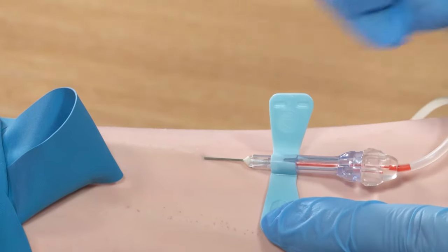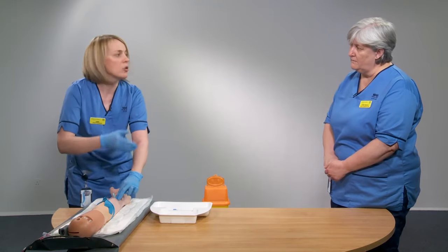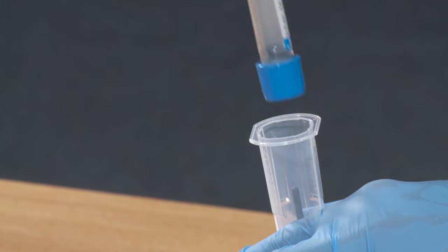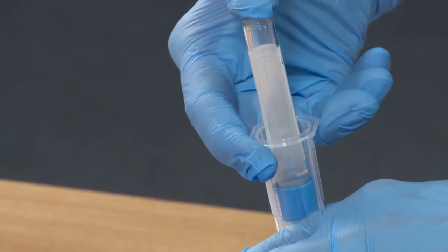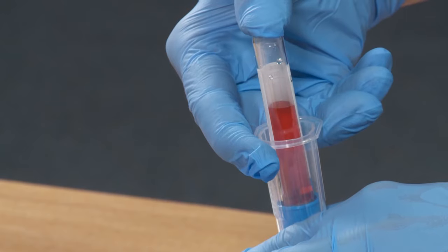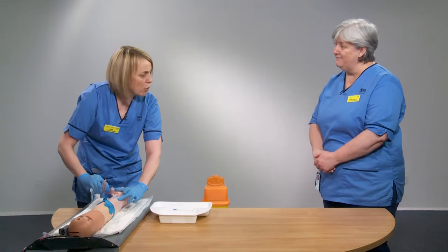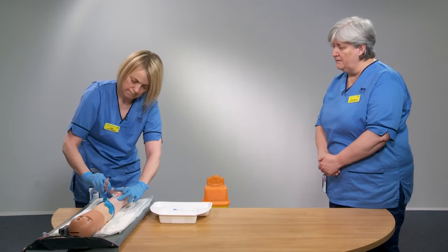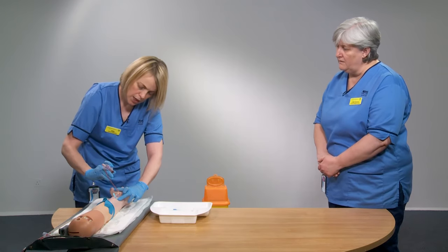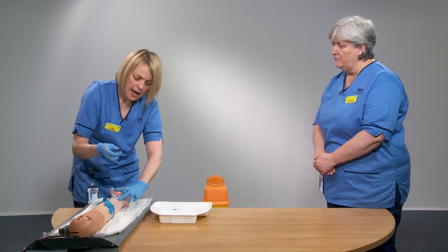To collect the blood, flatten one wing with one hand to stabilise the needle and prevent it dislodging, then use the other hand to attach the blood bottles into the vacuette. You will see blood travelling down the chamber and filling the blood bottle. Push the bottle on, and allow it to fill until it stops.